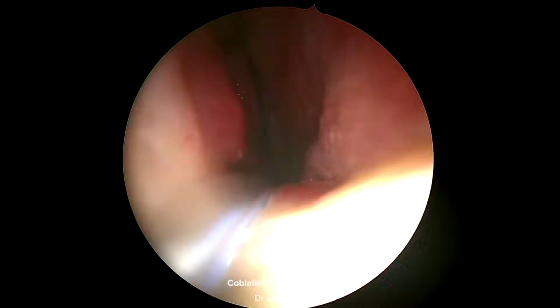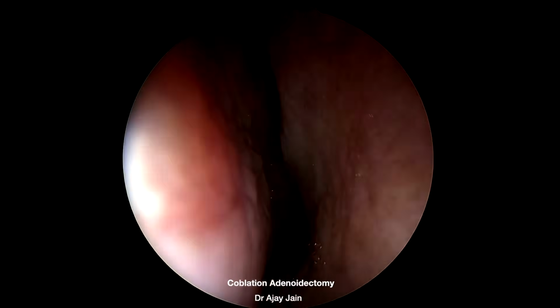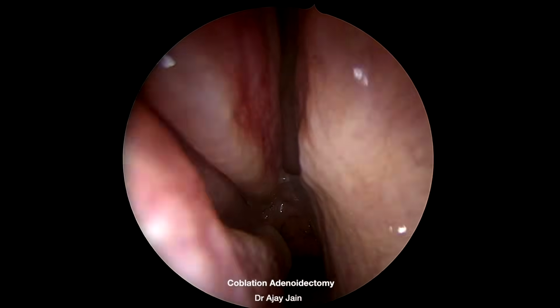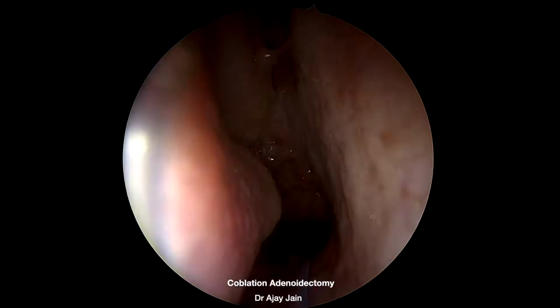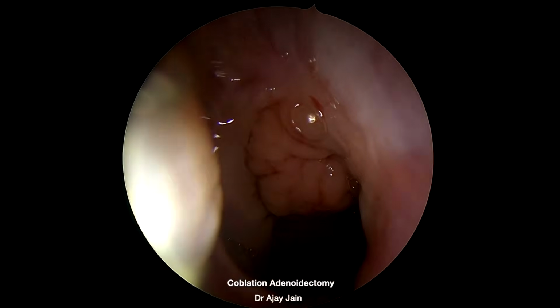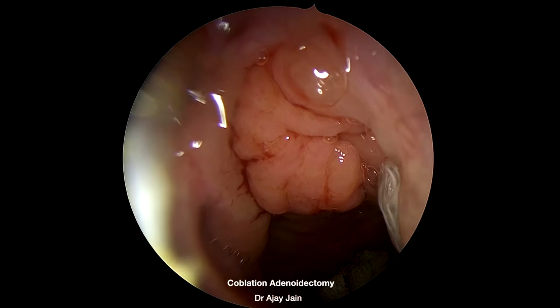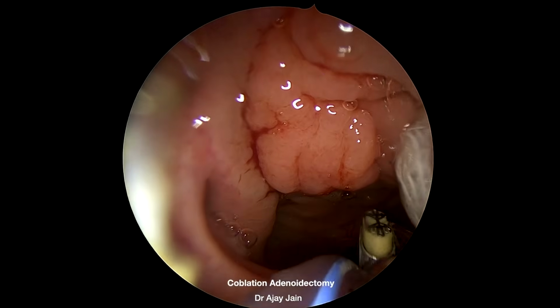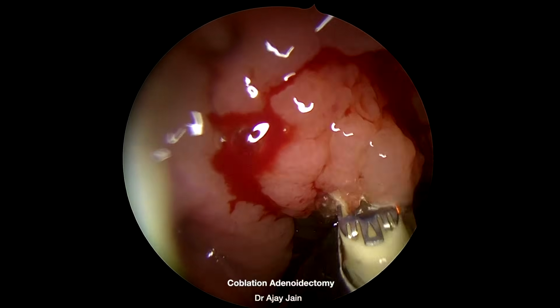Now, after many consultations, she was taken up for endoscopic coblation adenoidectomy under general anesthesia. After induction, a Boyle-Davis mouth gag was applied, and both nasal cavities were decongested using ribbon gauze soaked in adrenaline. The soft palate was retracted with an infant feeding tube catheter. A 4 mm 0-degree nasal endoscope was introduced through the right nasal cavity.